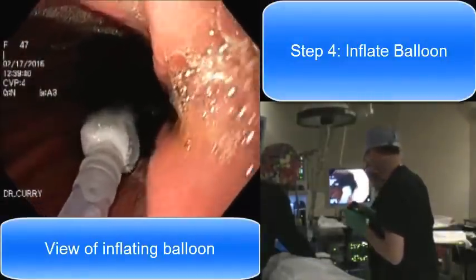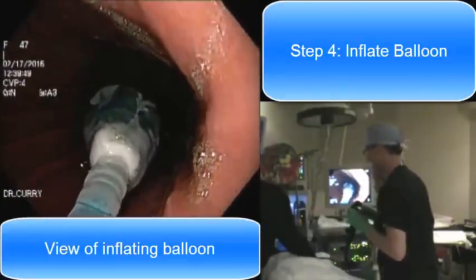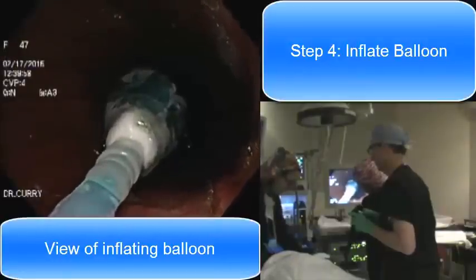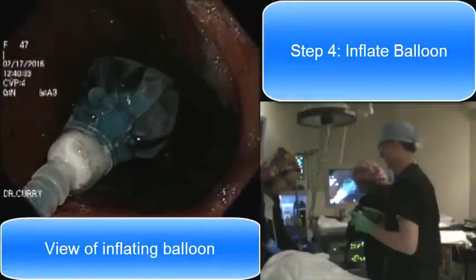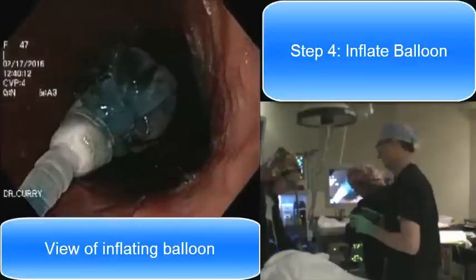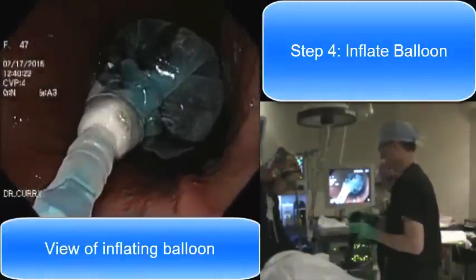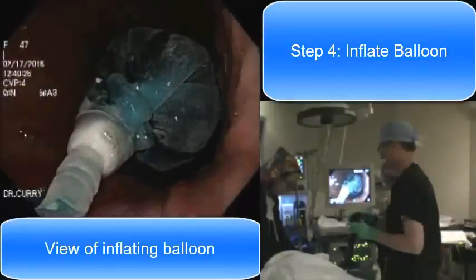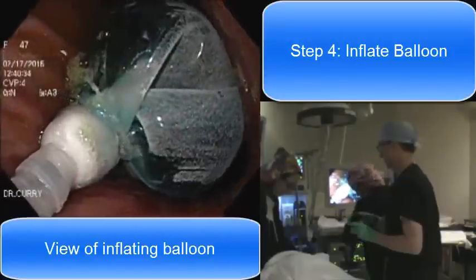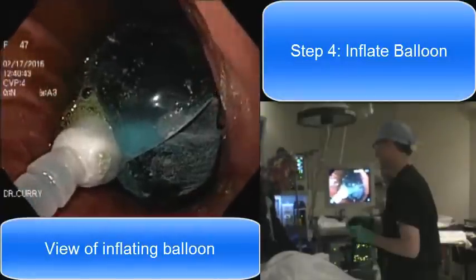My assistant in the background is getting ready to start inflating the balloon while I keep the scope focused on it so we can watch it inflate. You can see a little bit of saline going in — it's blue because we put blue dye in the saline. On the off chance that there is a leak or a rupture, the patient wouldn't know it because it would turn their urine blue, which would be a clue to give us a call. But that's very uncommon. My assistant is pushing 60cc syringes full of saline with methylene blue dye into the balloon, and we're going to put a total of 600cc of saline in this patient's balloon, which weighs about 1.3 pounds.